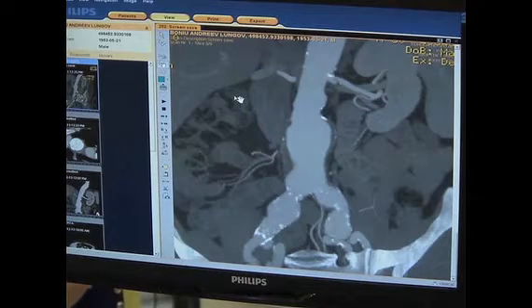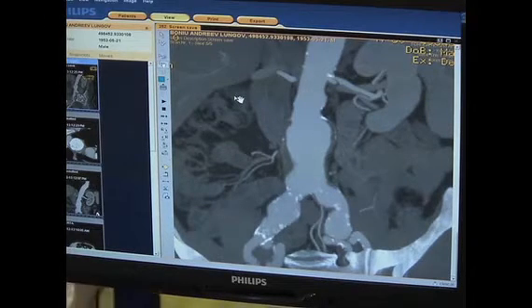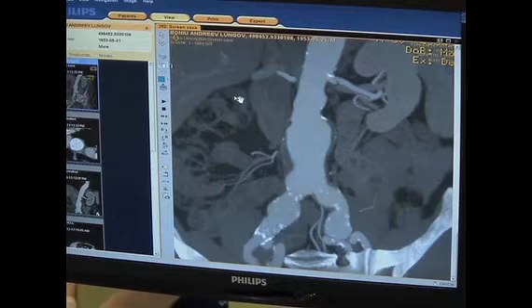Ivo, this is Dan Clare. What's the diameter of the iliac arteries on the left and on the right? Okay, on the left side, the diameter of the aneurysm is 24, the widest part, and we have a flared leg that is 24.